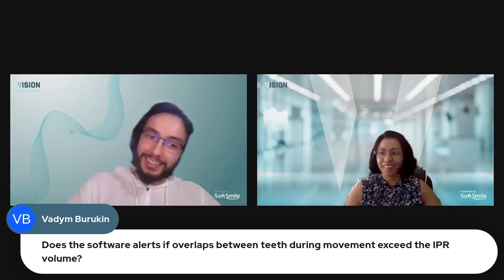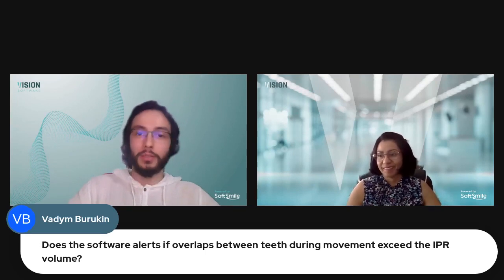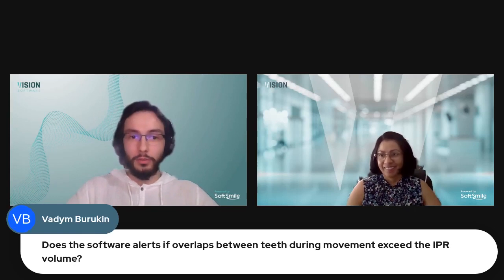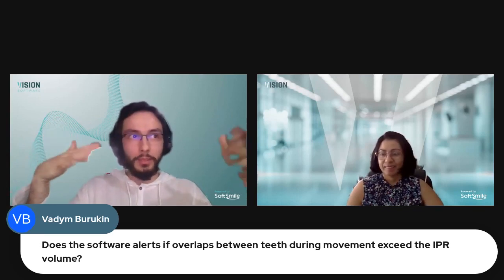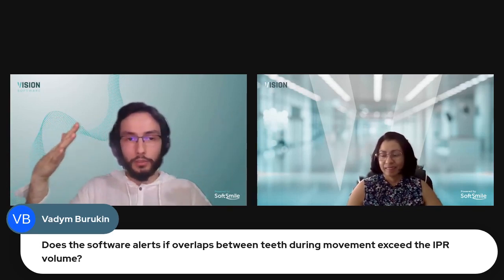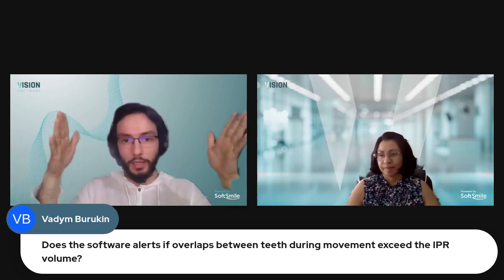All right. Does the software alert if overlaps between teeth during movement exceeds the IPR volume? Indeed, it does. There's a configuration where you can define what the threshold is. Typically, in our example, it is 0.9, so 900 microns. 0.9 is the maximum IPR.